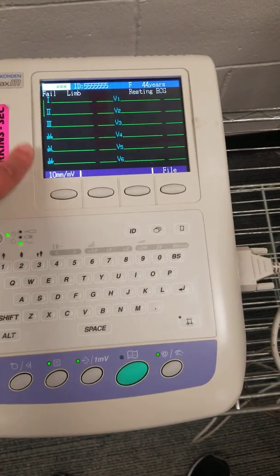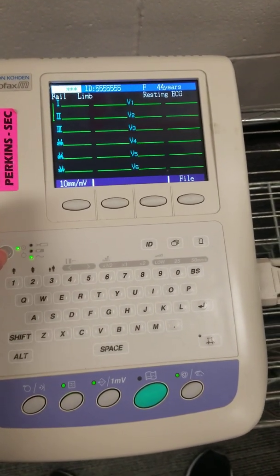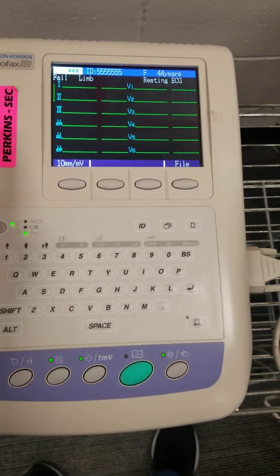This is a digital screen that shows all 12 EKG leads. If you have any of these that are highlighted, that means it's not going to print all 12, because it has the option to print more than that.